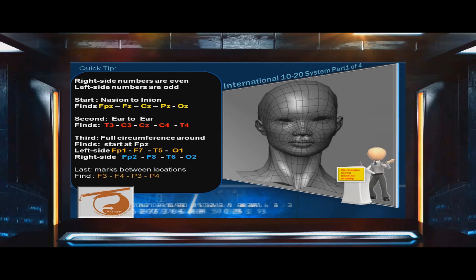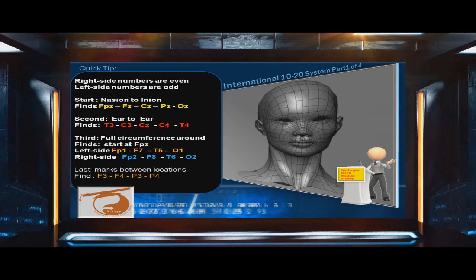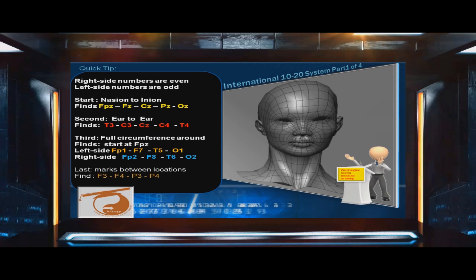Lastly, measure landmarks between locations F3, F4, P3, and P4.